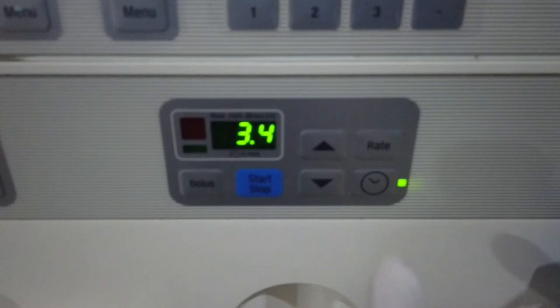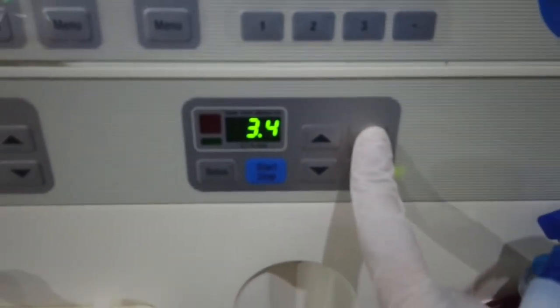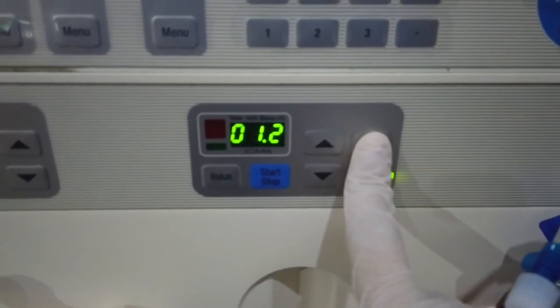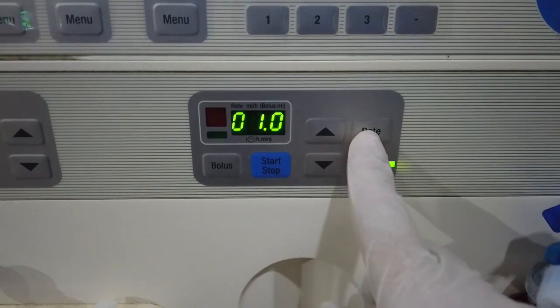Afterwards, set the heparin hourly rate. Click the rate button to set the rate, and the time button to set the interval time. Once the digits are blinking, you can then set the desired rate or time by clicking the up and down buttons. Once done, click the rate and time button again.